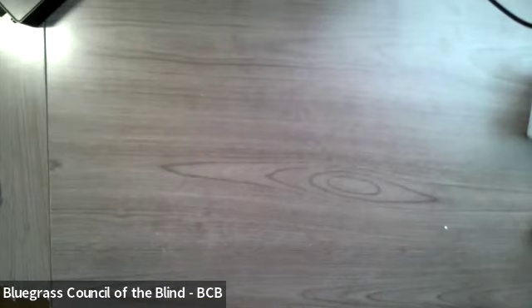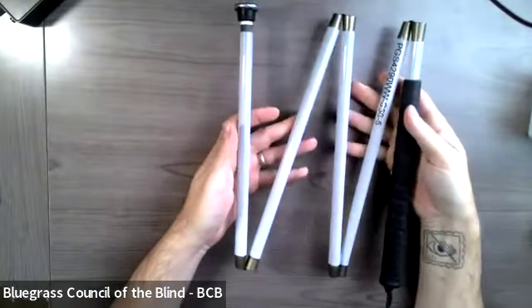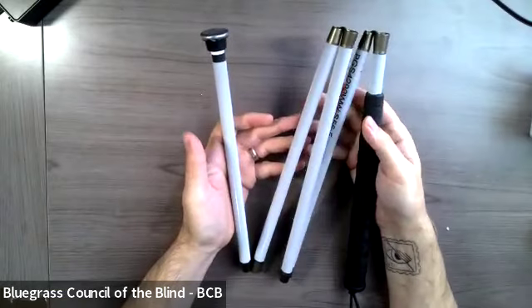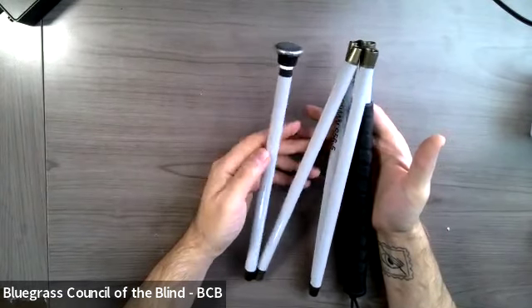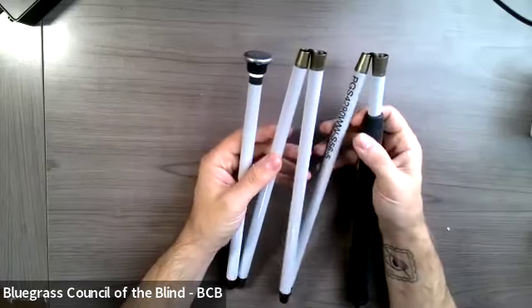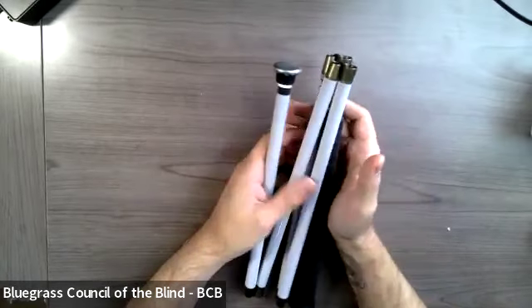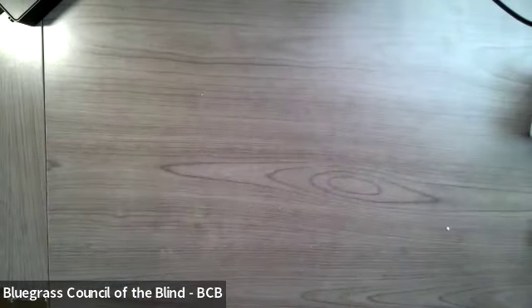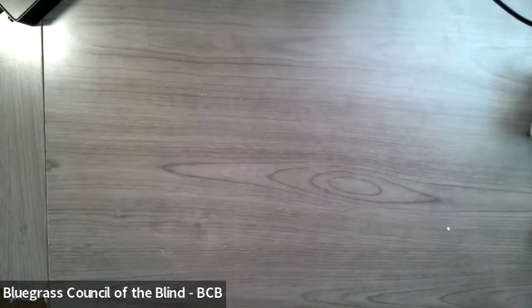If you do have a folding cane, like this is a folding cane I have here, you can see that it has multiple sections and each section is separated by a bungee, or there's a bungee going through the middle. You can choose how many sections you want on your cane. So if you were to get like a 56-inch cane, that's how tall the cane is, you can choose if you wanted 4 sections, if you wanted 5, if you wanted 6. This particular one has 1, 2, 3, 4, 5, has 5 sections. And the more sections, the smaller it folds down when it's all folded up. The smaller package it is when it's all folded up. So that's really the only benefit of choosing your sections, is how small it is when it's folded down.